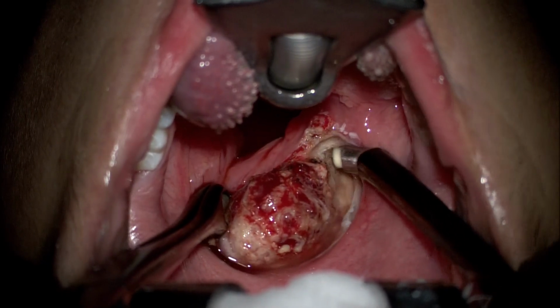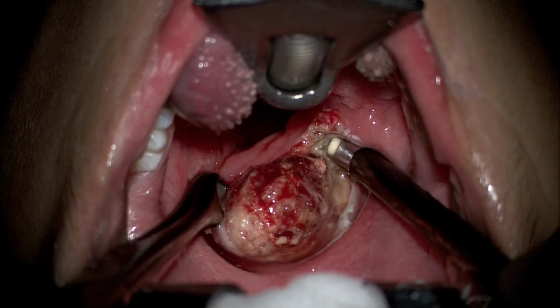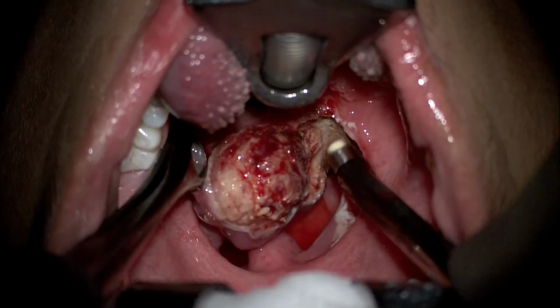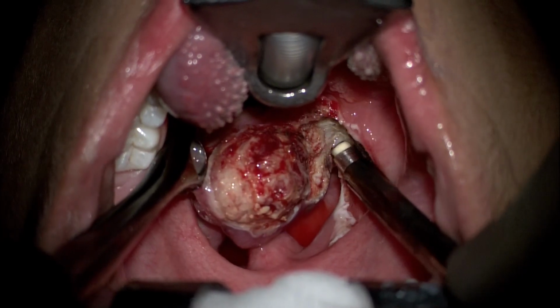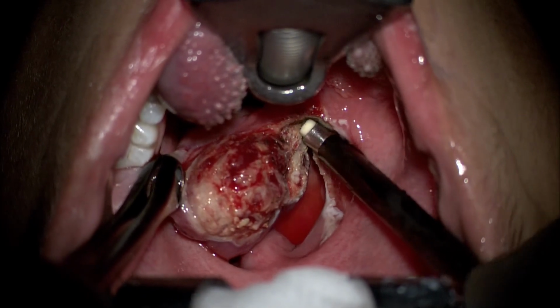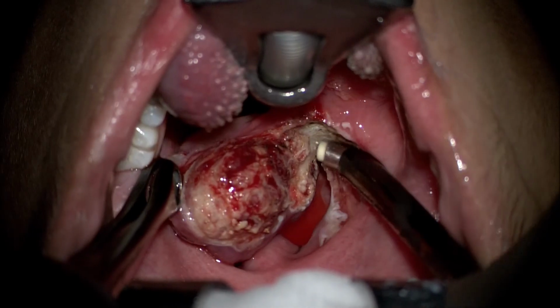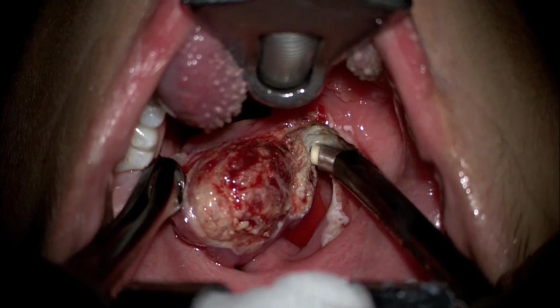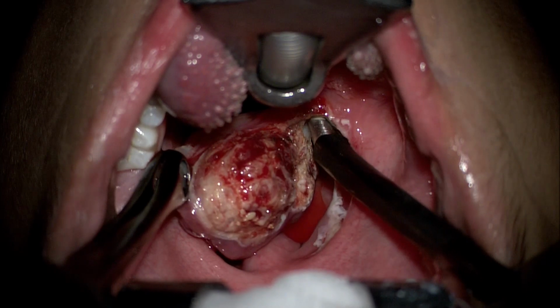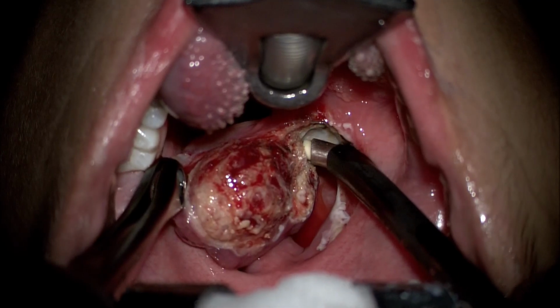Once again, the point is to spare the lingual tonsil and not cause any injury or ablation injury towards the base of tongue. Hence, the device must again point medially. At each point of time, we keep suctioning the fluid from the oropharynx. And like you see here, we are selectively using first the coagulation mode along the entire inferior part of the tonsil to be able to safely coagulate the vessels, the branches of the tonsillar artery that supply the tonsil, followed by the ablation. As you see again, a small bleeder was there which was easily coagulated using the coagulation mode.